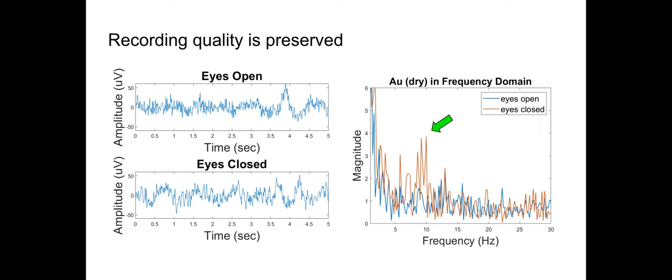Yeah, and in addition, you can also compensate. You can be smart with it and place the coil and electrodes in such a way that you can minimize at least the interaction between the two.